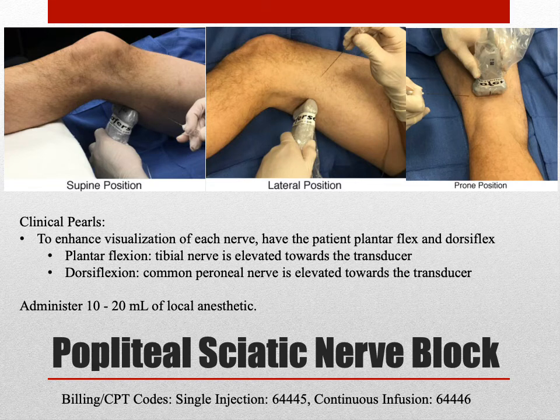If you're having difficulty visualizing each nerve, you can ask the patient to plantar flex or dorsiflex. When the patient plantar flexes, the tibial nerve is elevated towards the transducer. When the patient dorsiflexes, the common peroneal nerve is elevated towards the transducer.